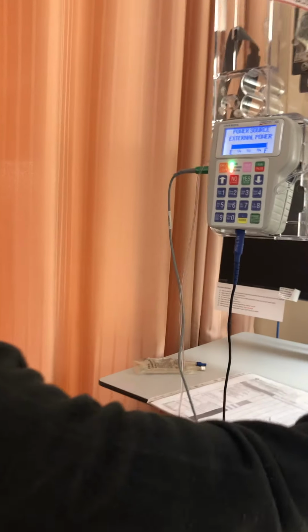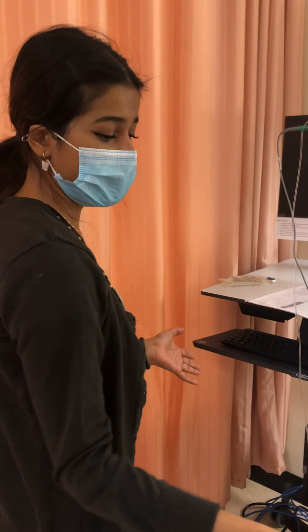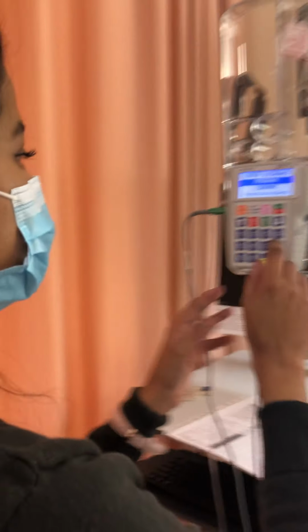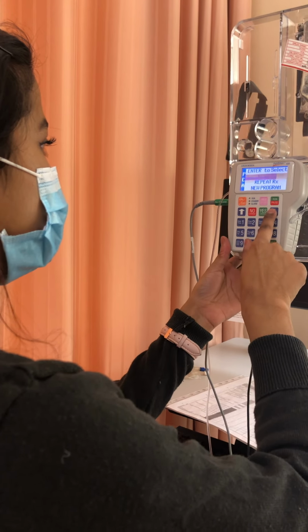This is the old bag. I'm just going to put this to the side. Oh, and we have a carrier line running, so everything's infusing properly. We have a carrier to keep the line open, and the patient has that, so it's infusing properly. Everything is attached, everything's good. So I'm going to go ahead and program my things. So I'll just do a new program.